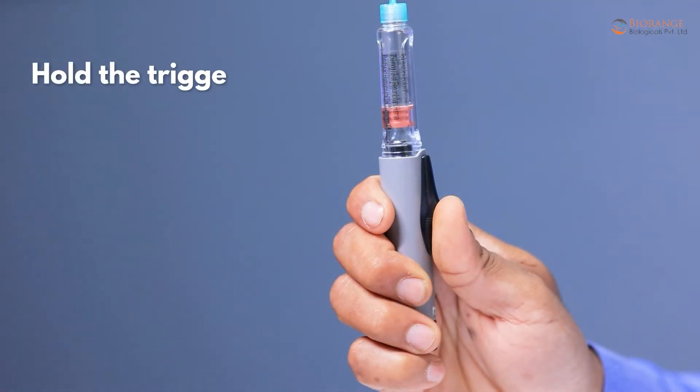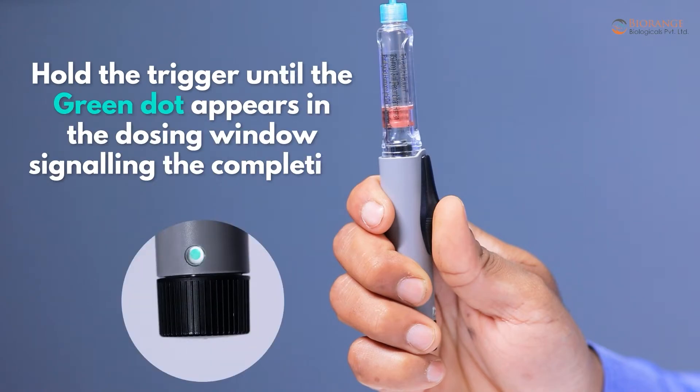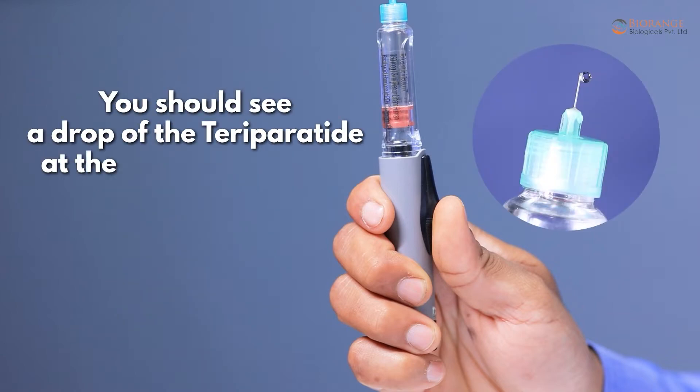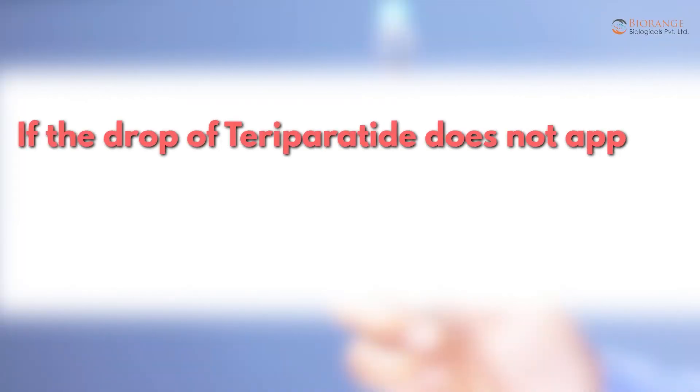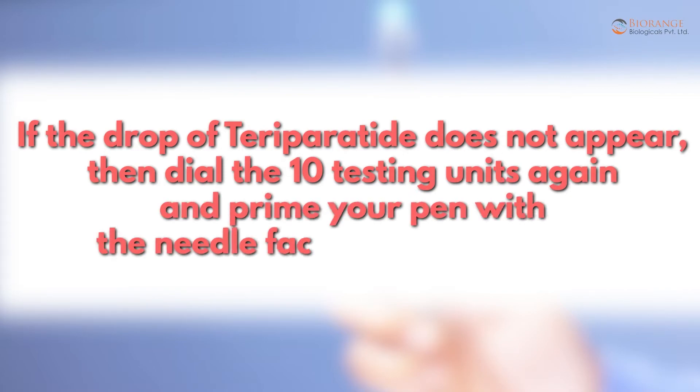Hold the trigger until the green dot appears in the dosing window, signaling the completion of the injection. You should see a drop of teriparatide at the end of the needle. If the drop of teriparatide does not appear, dial 10 testing units again and prime your pen with the needle facing upwards again.